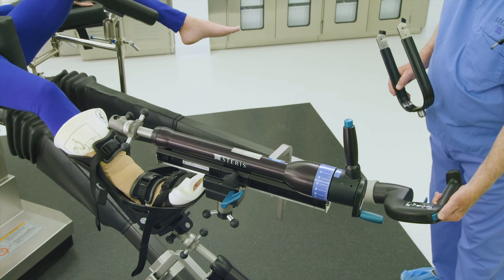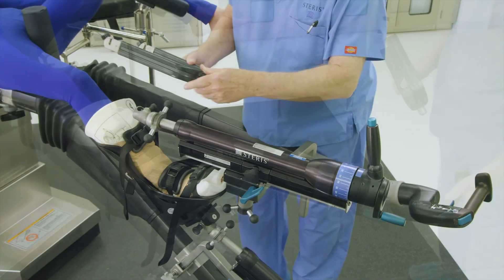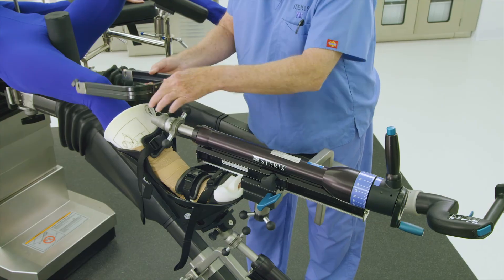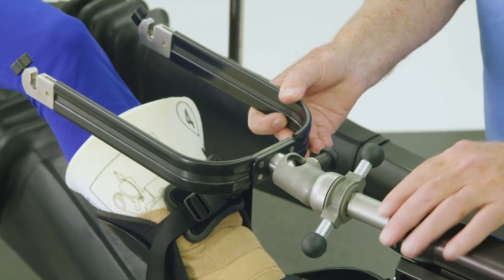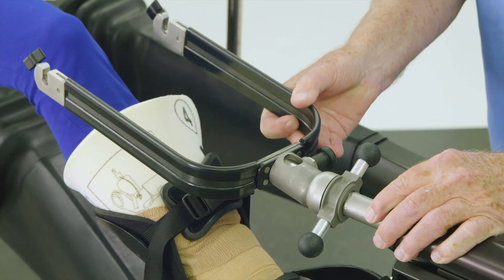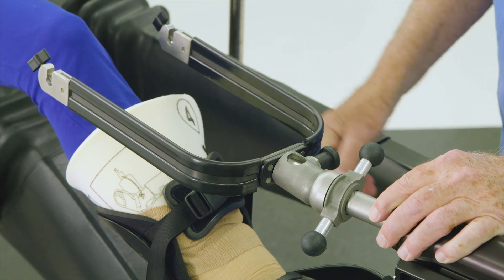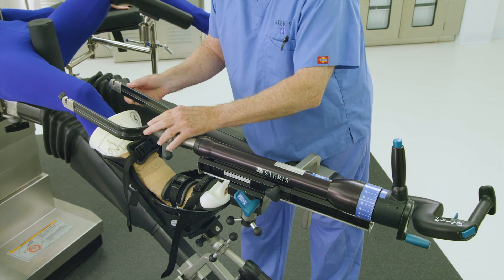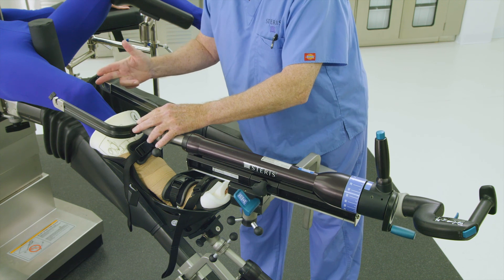Remove the traction boot if present. Insert the skeletal traction bow or the traction bow block to prepare to pull skeletal traction. Follow instructions for use for attachment of the K-wire employed. Adjust the gross traction slide as necessary for K-wire placement and pulling traction.